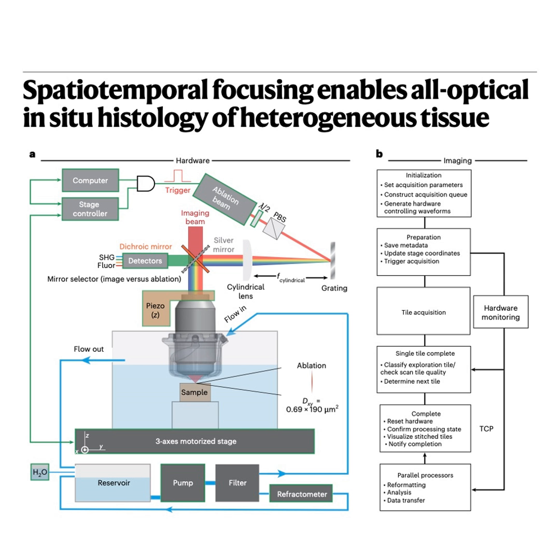It's great for ordered structures. Okay. And for the soft tissues, the neurons, the blood vessels? For those, it relies on fluorescence, either intrinsic fluorescence from the tissue itself or, more commonly, fluorescence from specific labels that have been introduced, like dyes marking the vasculature.